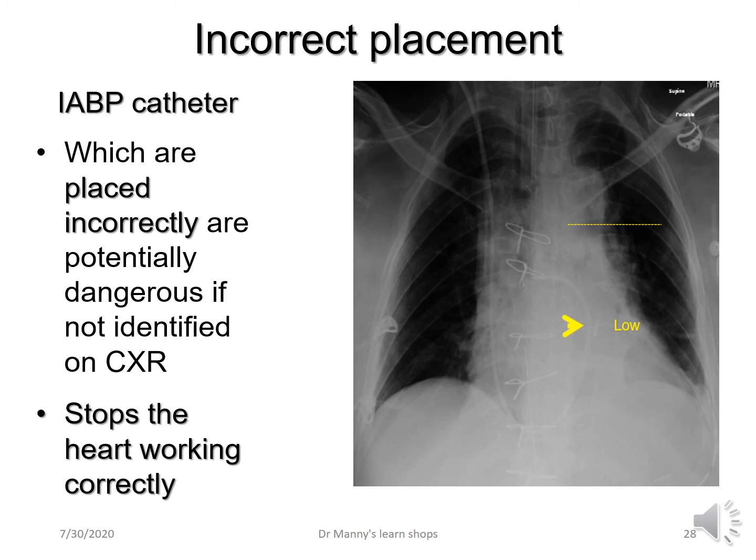So for example, not that I'm going into intra-aortic balloon counterpulsation in this Learn shot, if the catheter is placed too low, the balloon can actually obstruct the renal arteries and decrease renal perfusion, and one of the complications might be the patient might go into renal failure. Or if the catheter is placed too high, it can obstruct the subclavian arteries, the carotid arteries, which could impede blood flow to the head and to other parts of the body.